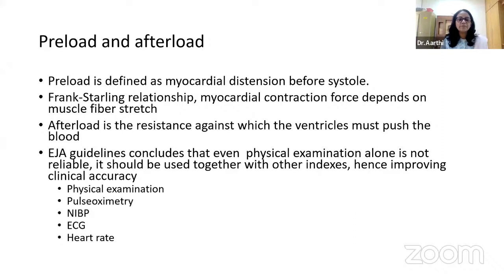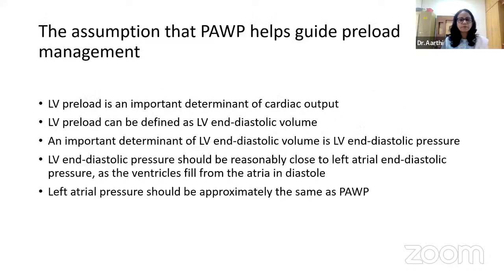Preload is defined as the myocardial distension before systole, and with respect to the Frank-Starling relationship, the myocardial contraction force depends upon the muscle fiber stretch, which is exactly the preload. And afterload is the resistance against which the ventricles must push the blood. The European guidelines suggest that apart from the clinical assessment, all these parameters should be guided by the physical examination, the basic monitoring devices, and the advanced hemodynamic monitoring devices.